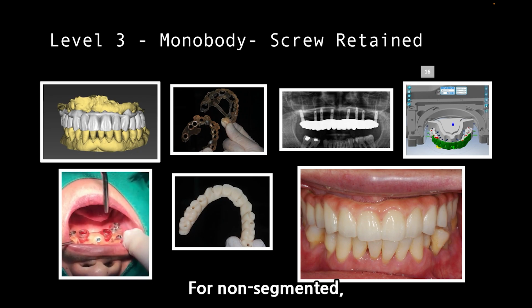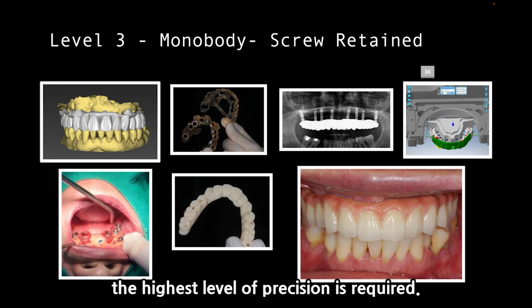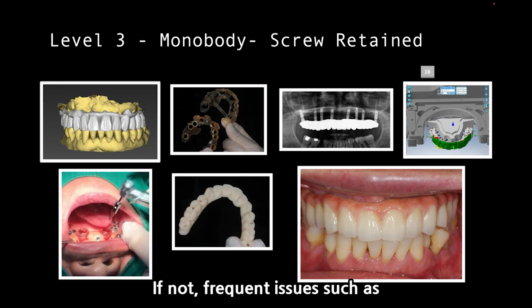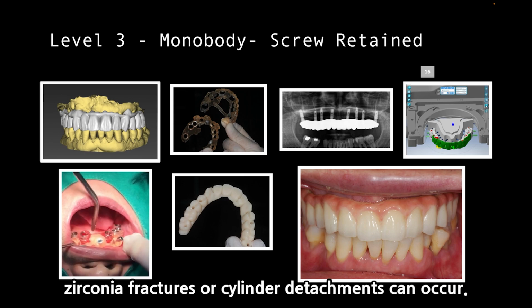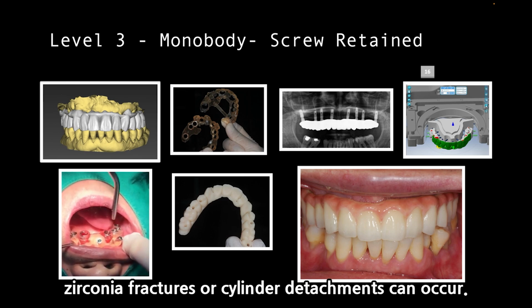For non-segmented single-piece screw retained prosthetics, the highest level of precision is required. If not, frequent issues such as zirconia fractures or cylinder detachment can occur.